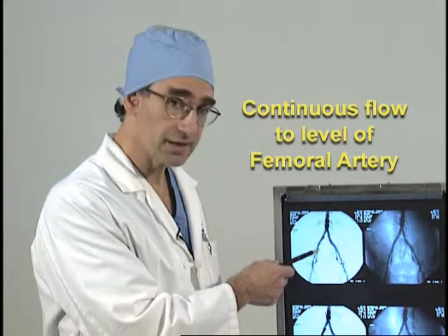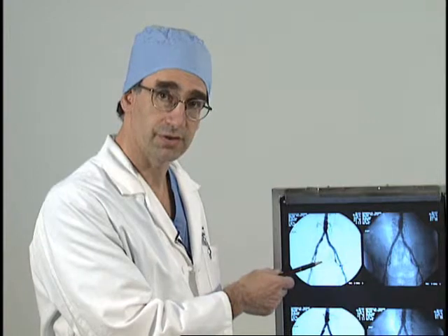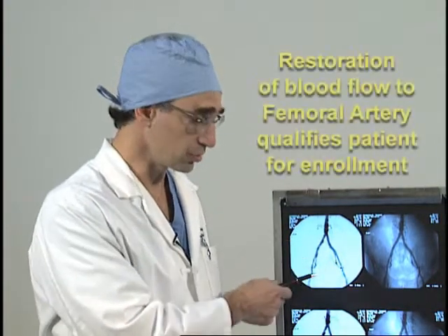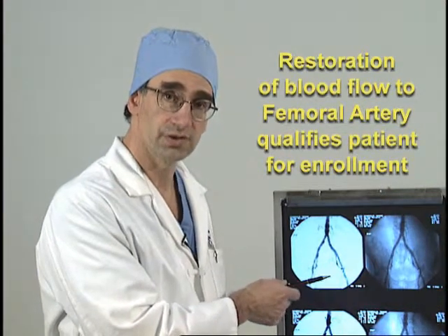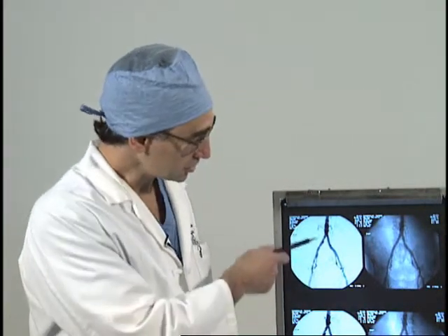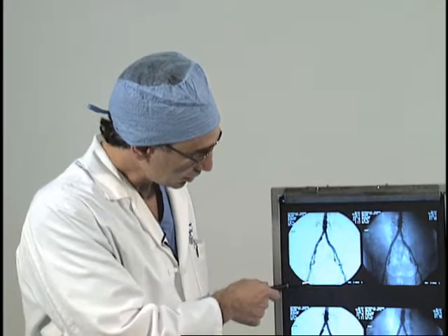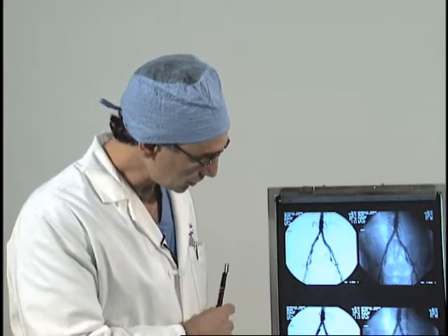However, iliac lesions can be treated with angioplasty and/or stenting or bypass. Any revascularization option that restores blood flow to the level of the femoral arteries will result in the patient qualifying from that perspective for enrollment in the trial. In this study, we see a typical scenario of through and through flow on both sides, straight through the iliac and the femoral arteries.